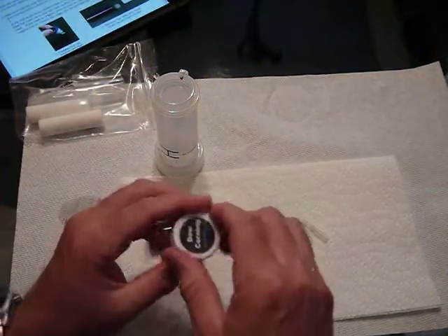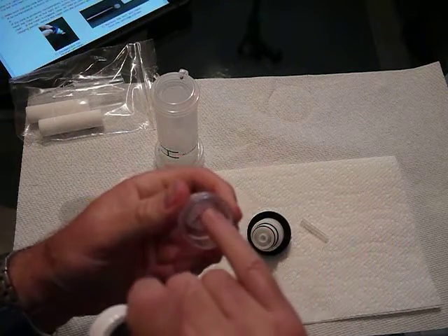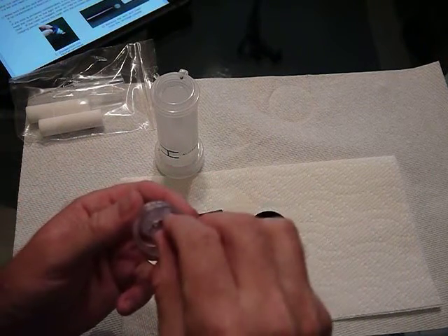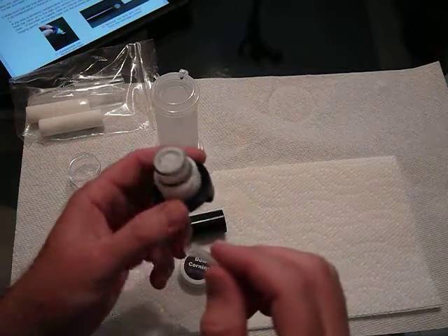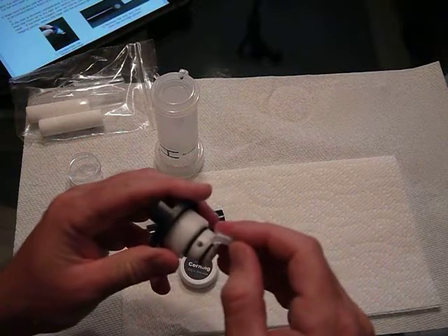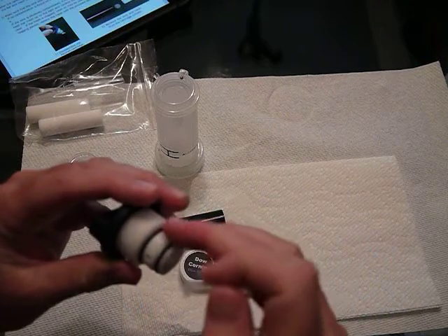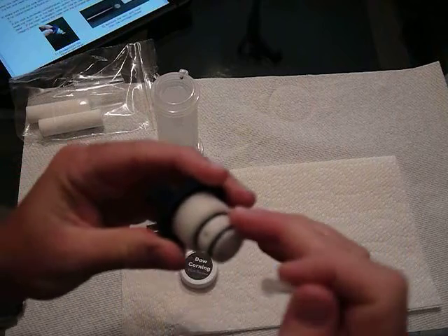So one of the maintenance items is this silicone grease that's included. I just use my finger here a little bit. Actually, you know what? I'm going to use a little piece of tubing. This is just spare tubing I have. Now I don't want a whole lot. I'm just going to dab some, and I'm going to spread it with my finger. I want a very light coating.